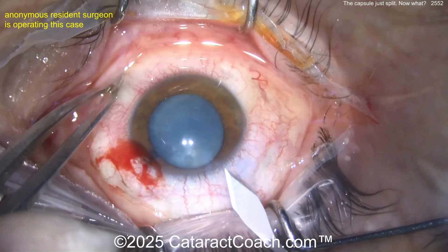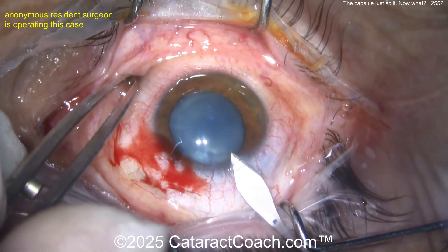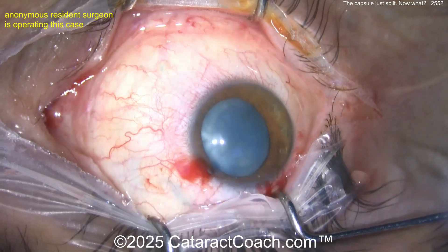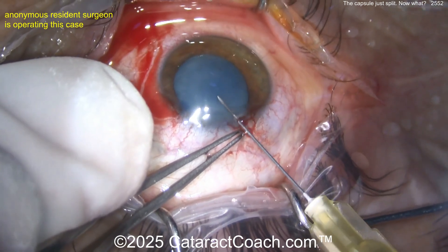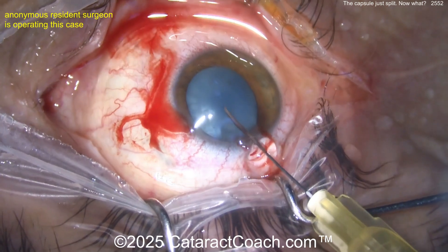You may be better off doing this decompression through the paracentesis without the main incision. Why? Well, as soon as you make the main incision — now that incision is larger — you're going to get viscoelastic prolapsing out of it. Look, it's already coming out. And you're not going to be able to get as high an IOP inside the eye. You can't have as much anterior capsule flattening from the viscoelastic. So now poking in with a needle — and you know what's going to happen.